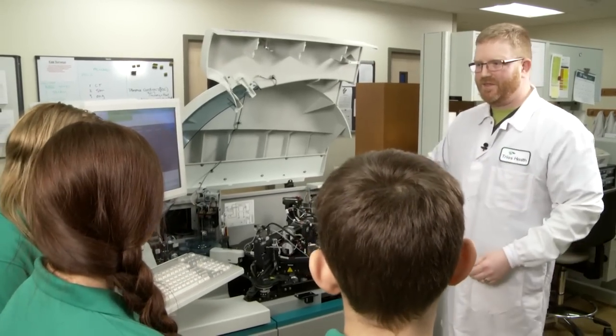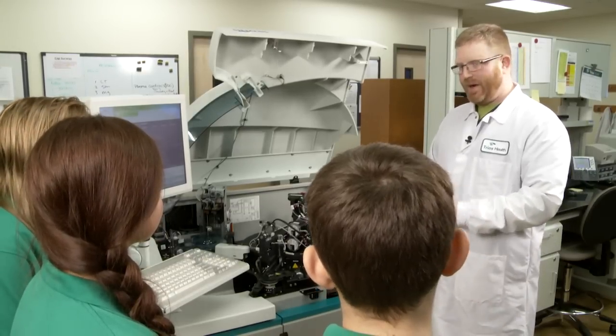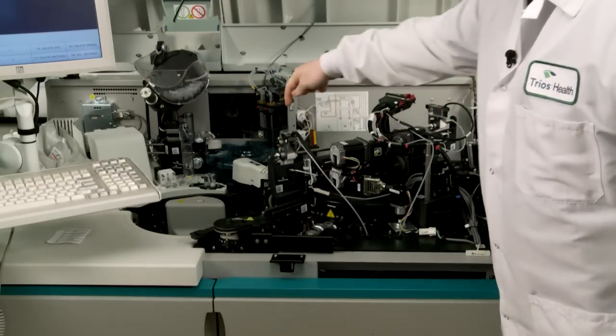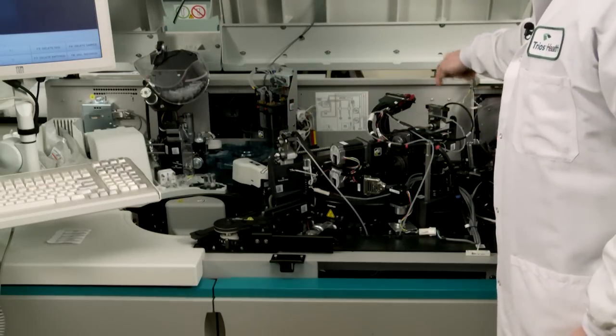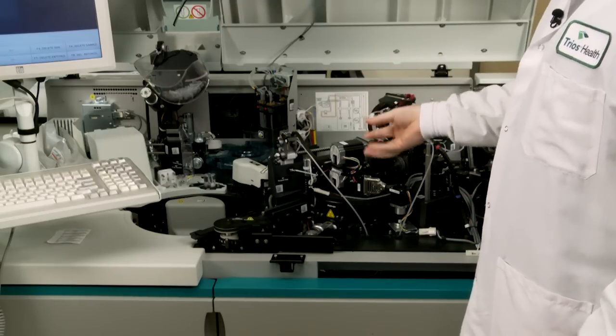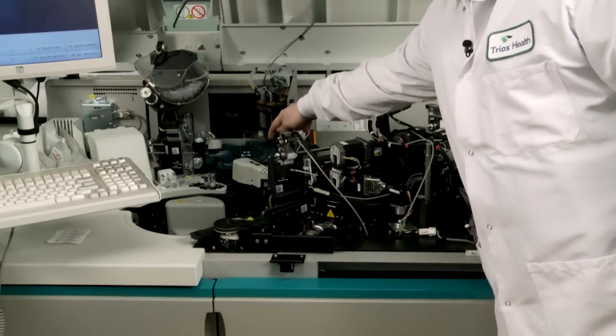Inside here we use different types of reagents — different chemicals — and they come in little packs and they go inside this wheel over here. You'll see there are two arms, one on either side, and those are used to sample the chemicals. It sucks up a little amount of the chemical and puts it into a tube over here in this wheel.